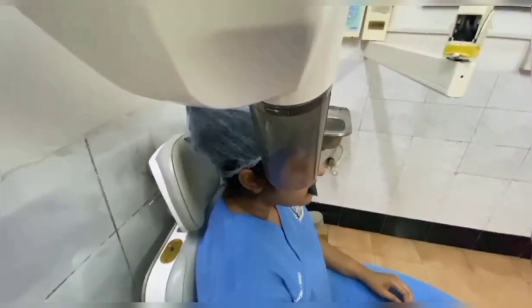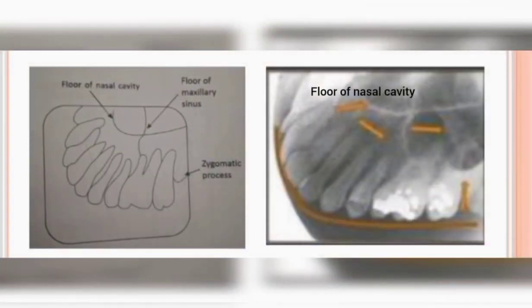Exposure time is 0.32 seconds. It shows the floor of the nasal cavity, floor of the maxillary sinus, zygomatic process superimposed with the roots of the molar teeth, and teeth from lateral incisors to third molar.